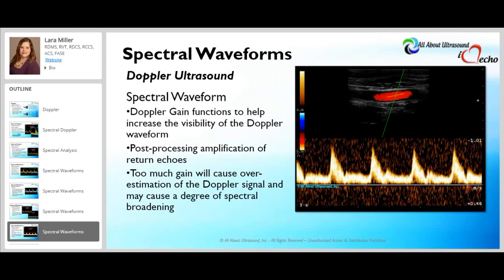Doppler gain is a function of post-processing amplification — it amplifies return echoes without increasing output power, and it functions to increase the visibility of the Doppler waveform. However, too much gain will cause overestimation of the Doppler signal and may cause a degree of spectral broadening to occur.